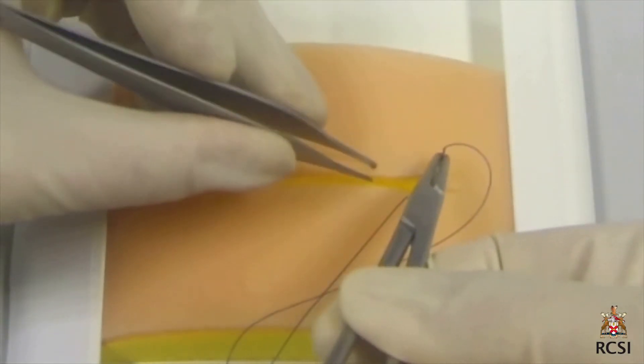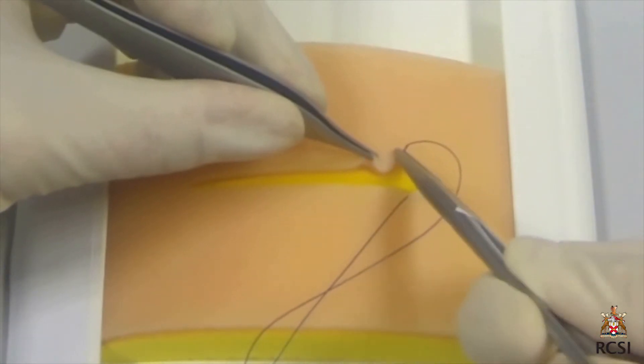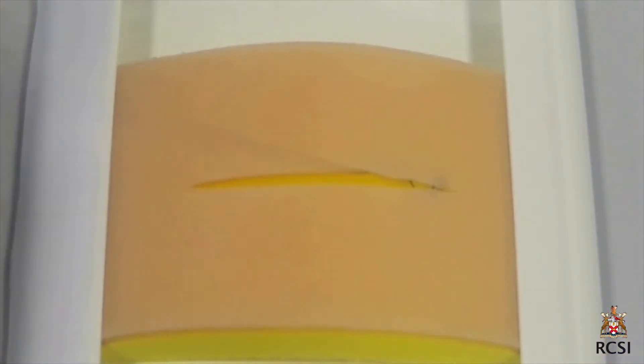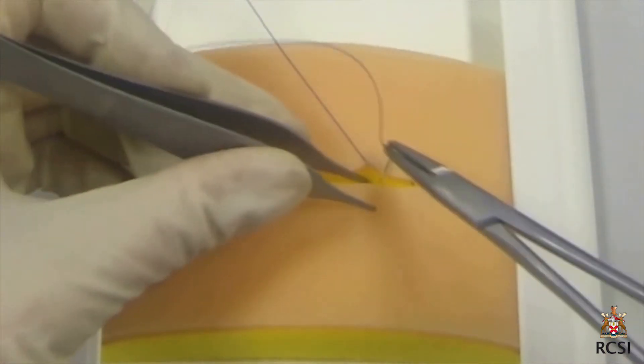This video demonstrates how to do a subcuticular suture to close a wound. This suture is used when the tension is minimum in the wound and the subcutaneous dead space is eliminated.